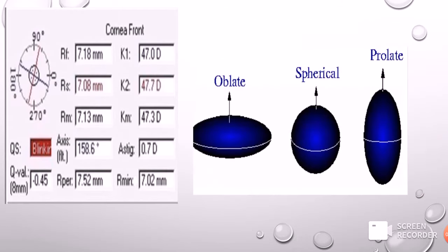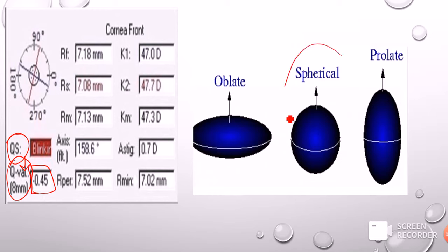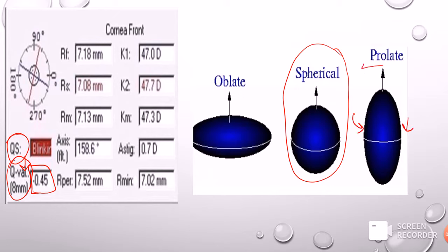On the printout, just below the quality specification we have the Q value. A normal sphere has the central part more spherical and peripheries flatter — that is the prolate shape. The oblate shape is when the center is flat and readings are more than 0.